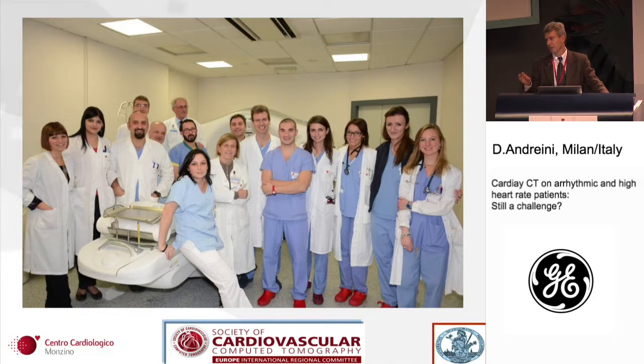The 20% correspond to the patients that arrived with the previous scanner to our lab, and in which we can do the cardiac CT for very, very high heart rate or atrial fibrillation. But obviously, we have other advantages that you already underlined in terms of safety, particularly the amount of contrast, and the dose that was reduced, as you told, with an average of at least 50 to 70%.